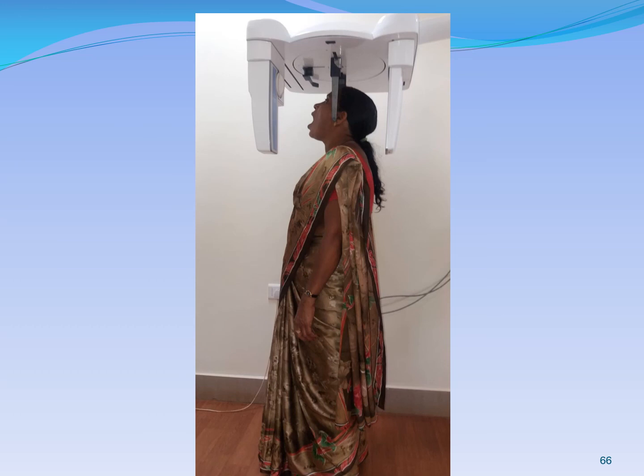Now, all these radiographs which I spoke of, I mentioned that a cassette has to be placed in a cassette holding device. All these radiographs were taken in a standard traditional machine. Now, as digital imaging has taken over, the cassette has been replaced by a sensor, as you can see in the image over here. The patient positioning for all the radiographs which I spoke of earlier remains the same. Only thing is, instead of a cassette, there's a sensor attached, and then the exposure is made.